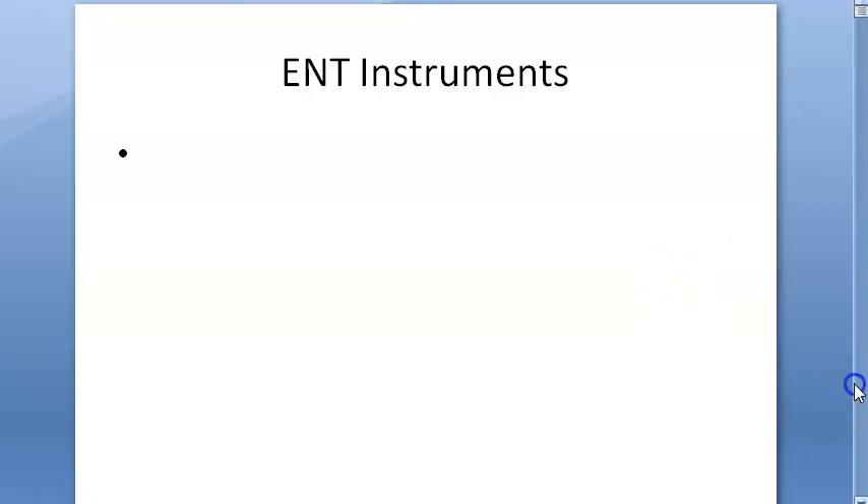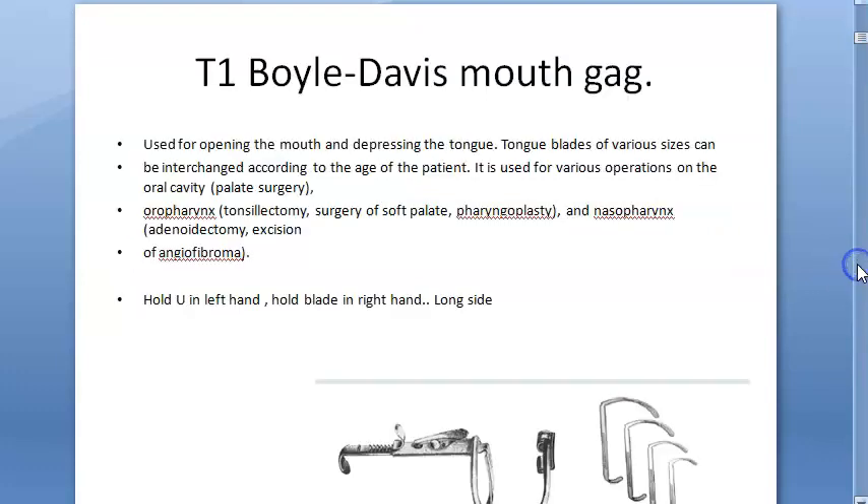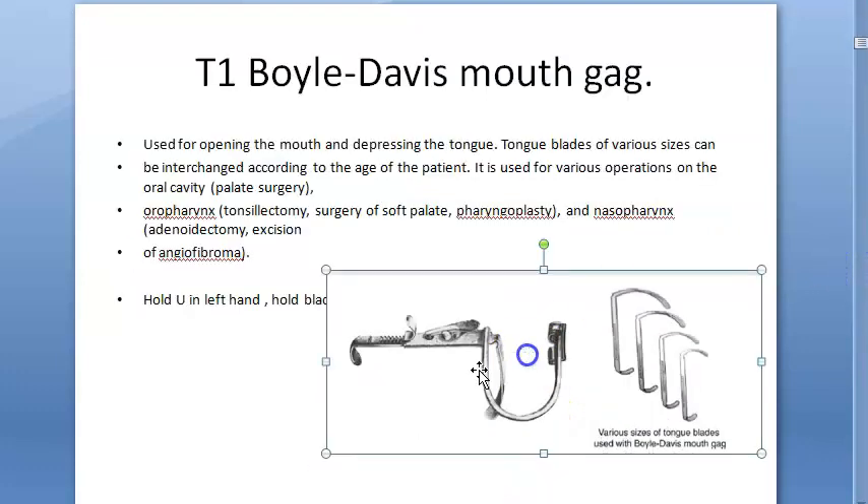Let us look at some ENT instruments — specifically the tonsillectomy instruments. Here you have the Boyle-Davis mouth gag. This is what you hold in your left hand, and in the right hand you will hold the long part of the blade, and then you will insert it.